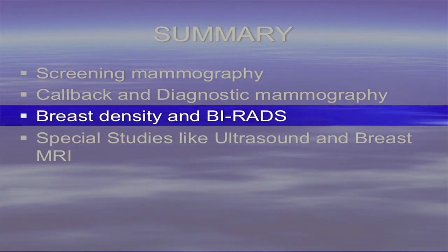Breast density and BI-RADS, remember the scattered, the fatty breasts, mammography is wonderful. The denser breasts, you really got to emphasize monthly self-breast exam and consider other things, especially in a higher risk woman, maybe tomosynthesis, maybe ultrasound, maybe breast MRI. Again, you have to look at the patient overall, not just the mammogram.